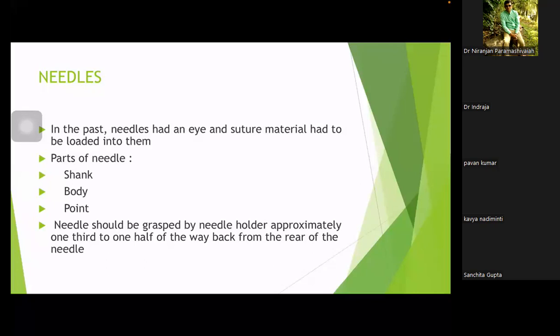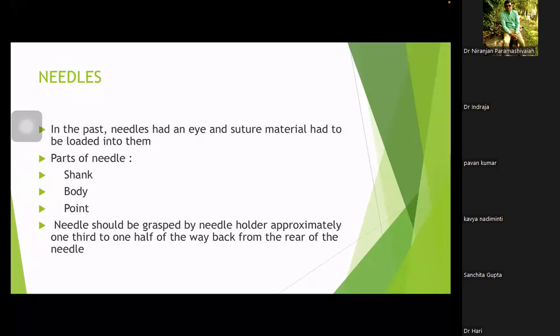Niranjan can also comment on this. That is what the current recommendation is, more for delayed absorbable. But depending on your preference, you can use nylon or also polypropylene. Many of the surgeons and also the literature say delayed absorbable is fine, which is polydioxanone, PDS.